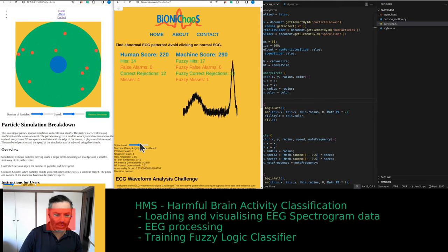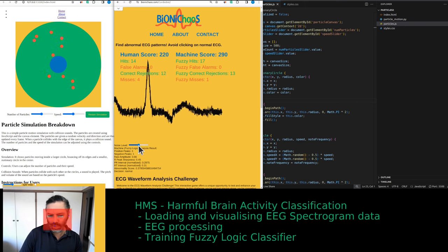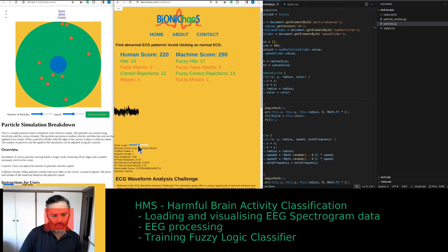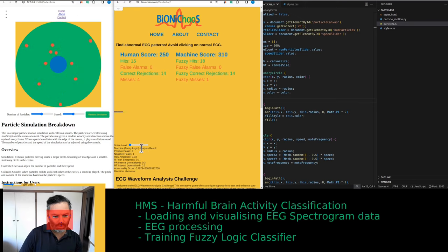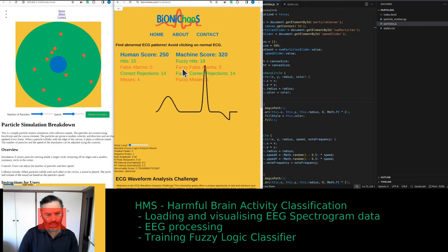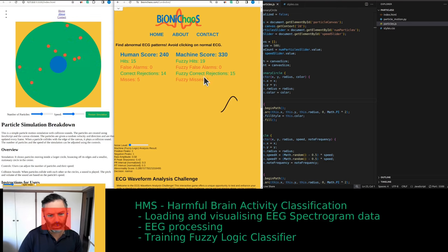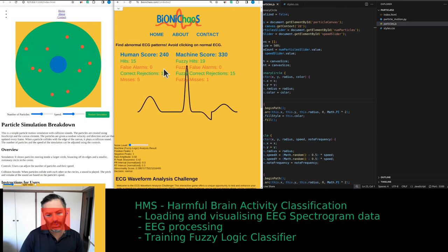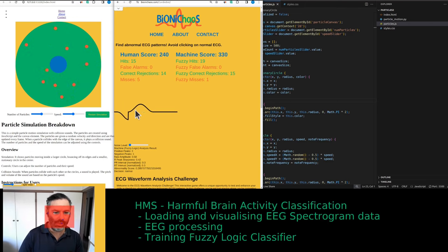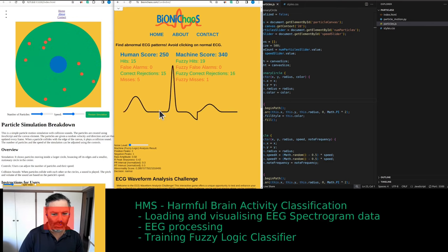Some are harder to detect than others. You can also reduce the noise and see how it affects the robot and your own performance.